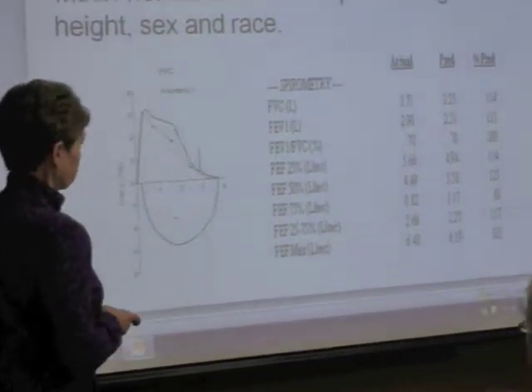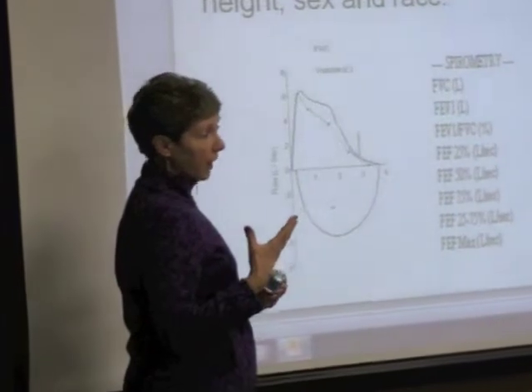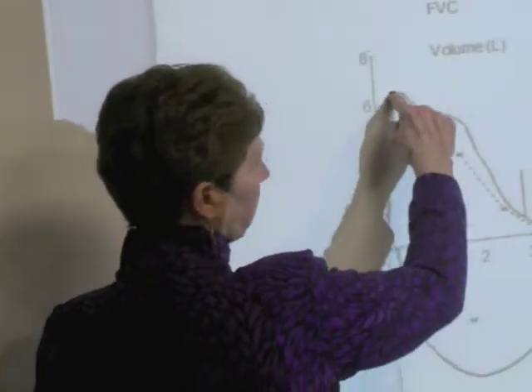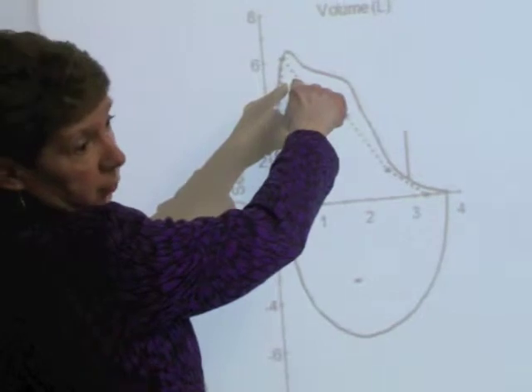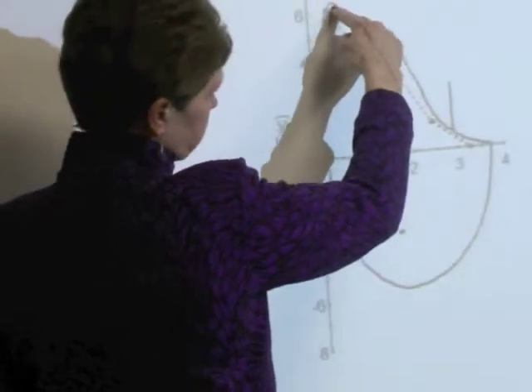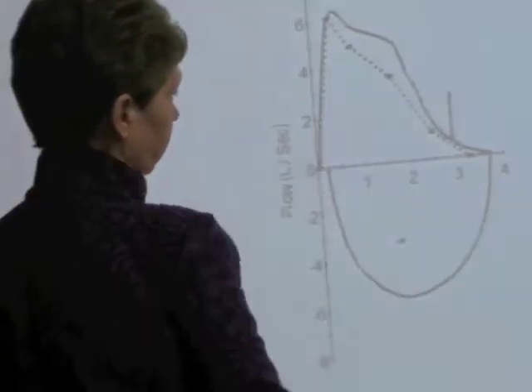This is a normal person, like I said. This is what's called a flow volume loop, and it is a graphic picture of me. First of all, I've sucked in a big breath and I blow real hard. This is what we call the peak flow. Some of you have peak flow meters, like the asthmatics do, and they check their peak flow. That's the maximum force that I was able to exert. I blow out, I get down to empty, and then I pull back in a breath.